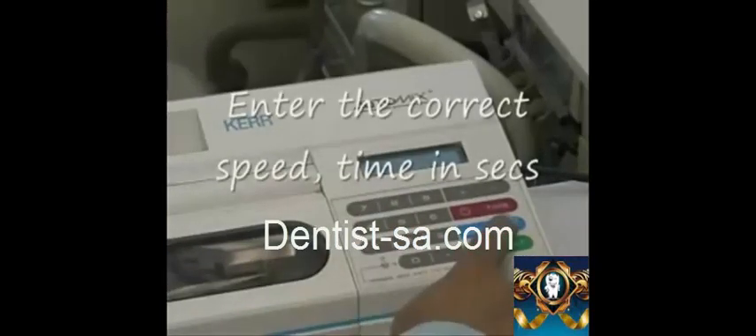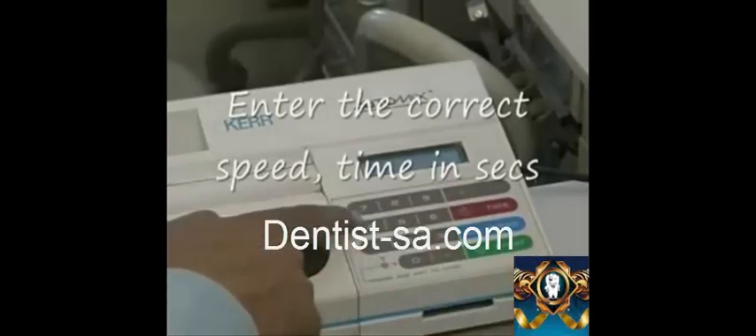To set the speed, push the speed button and enter the correct speed using the keypad.